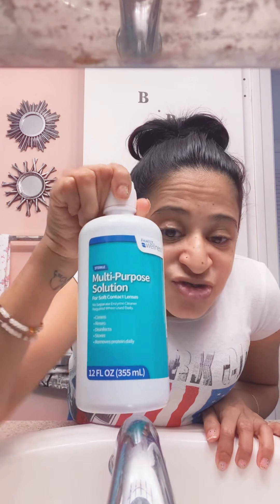I'm gonna be showing you guys how I clean my eye contacts. I have a few here. I clean them out with water first, then after I rinse them out with water and make sure I get them clean, I pour some of this multi-purpose solution into the container. I leave it there for like 4 to 6 hours, and then I try it on. If it still bothers me, I go ahead and redo the whole process all over again and leave it overnight. That way it gets all the bacteria and gets them all cleaned up.